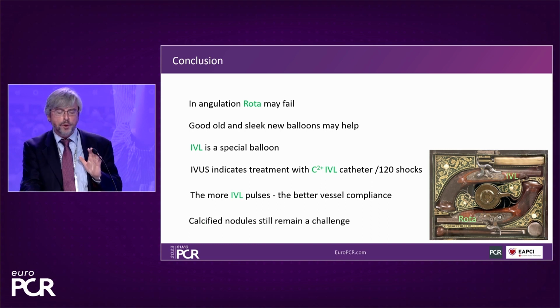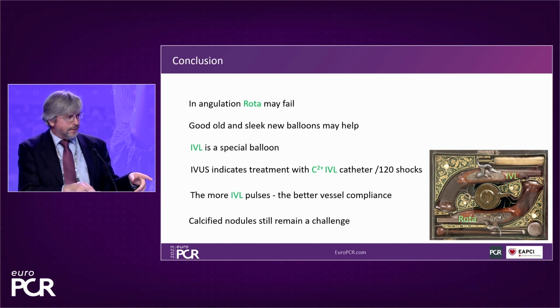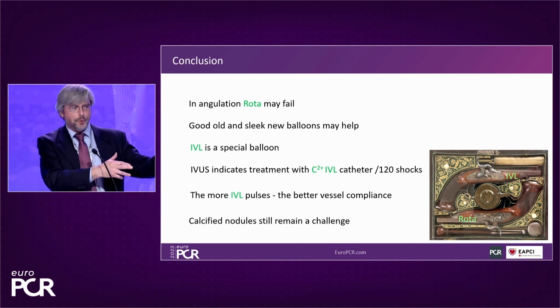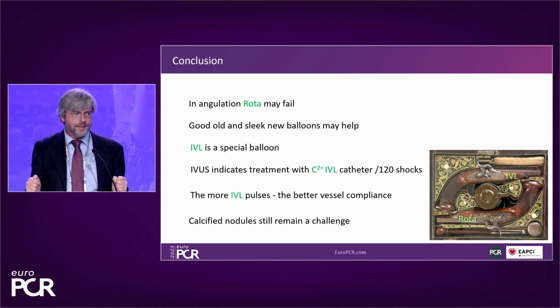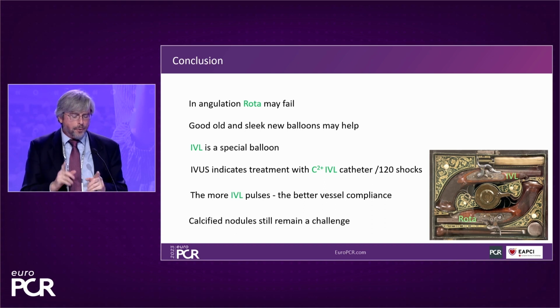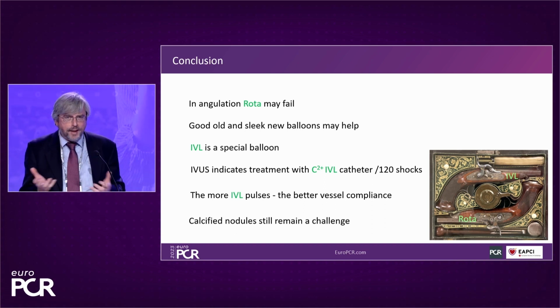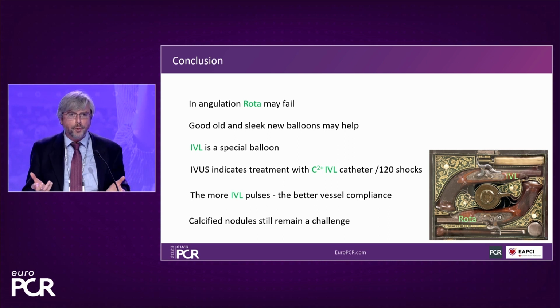And I want to have one more sentence on calcified nodules. We were already addressing this, but I didn't get a chance to talk. Hope it was good because we saved time that way. You know, we have these eruptive nodules and we have the stable nodules. And I want to address that the eruptive nodules are still really a thing we don't know what to do.